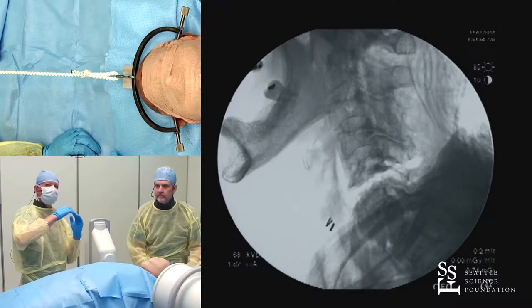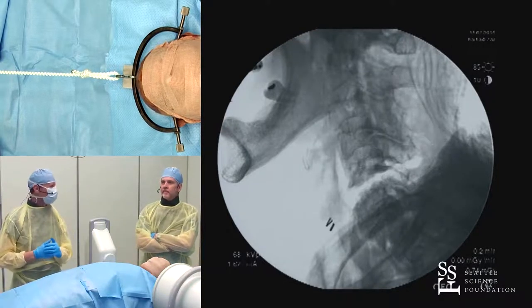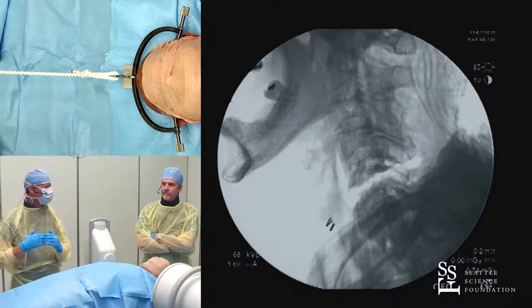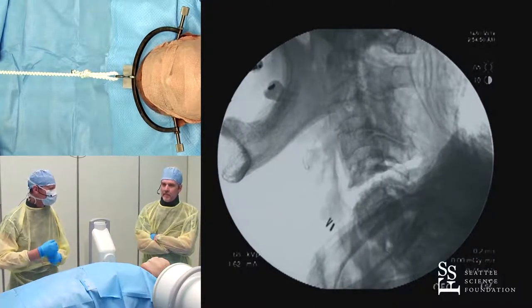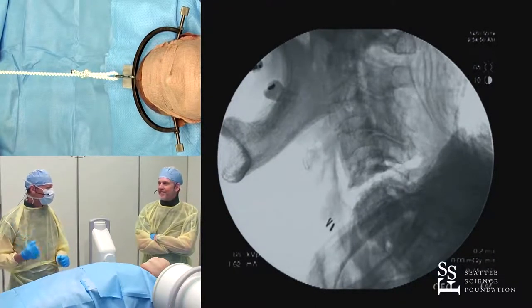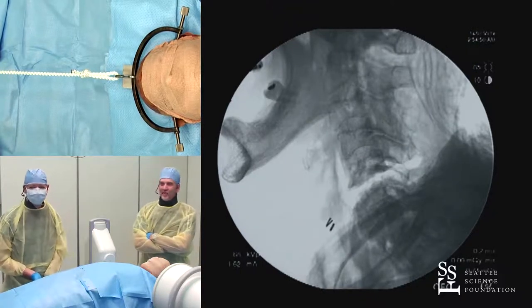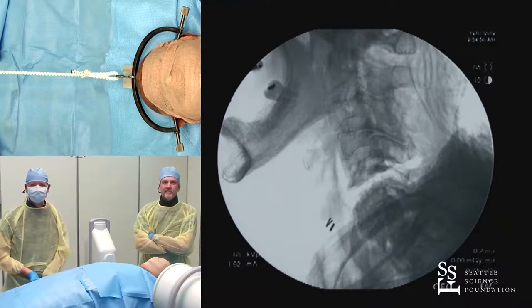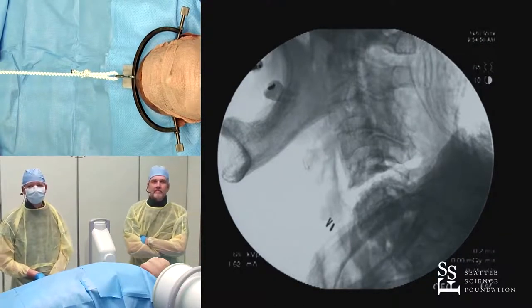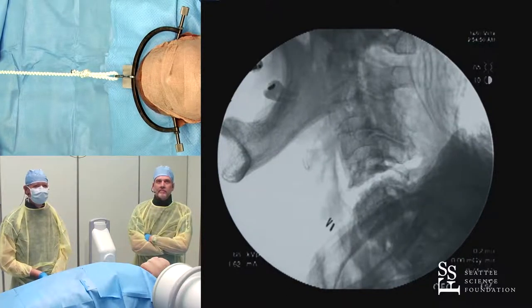That's the subtle piece — looking carefully at the X-rays. Unfortunately, this cadaver specimen is a very unstable, vertically distracted injury rather than a facet dislocation, so it's hard to demonstrate reduction techniques here. So tell us about the differences in your technique, if any, between bilateral and unilateral facet dislocations.